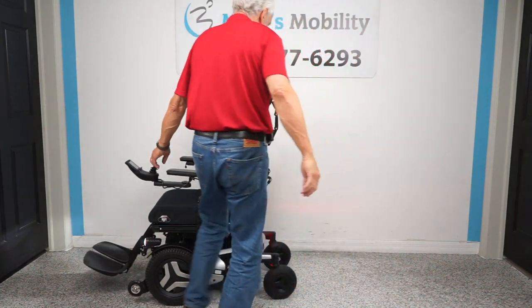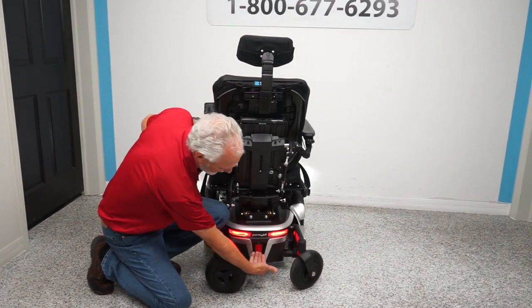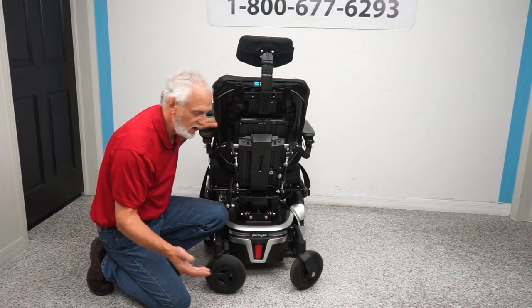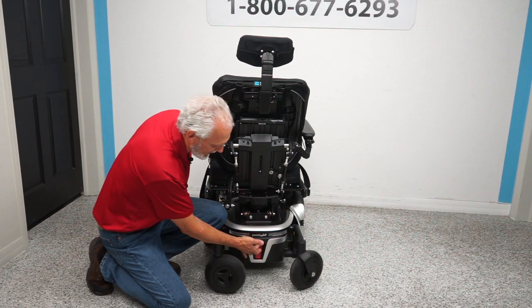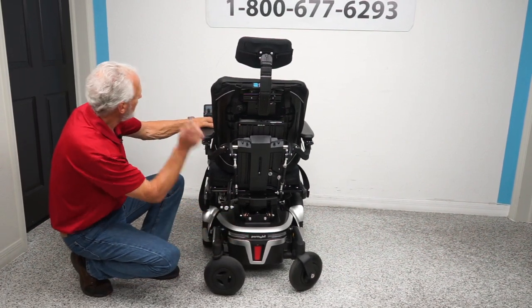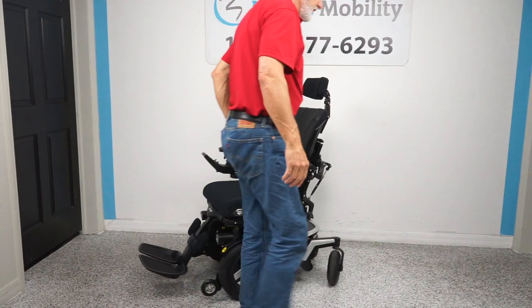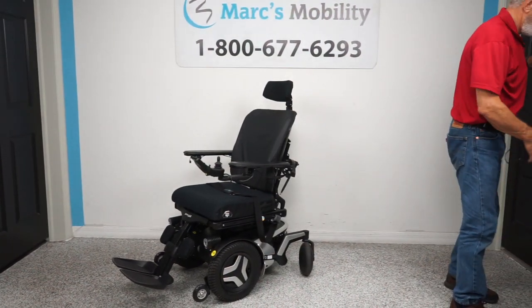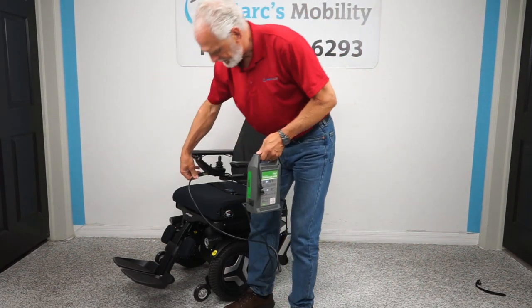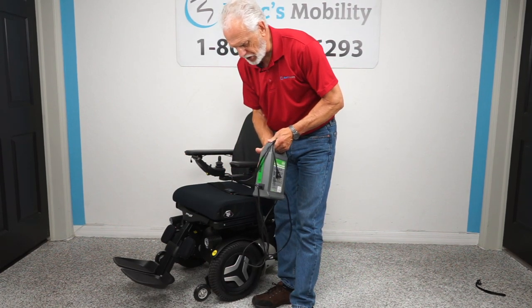When we ship these chairs, we always turn the power off at the breaker in the back — there's a lever right there inside. I just turned the whole power off. That's your breaker. When I turn it back on, I'll have to turn it back on up front as well. When charging, take your Permobil charger and plug it right in. Once the light goes to full, the charger stops automatically — these are smart chargers.